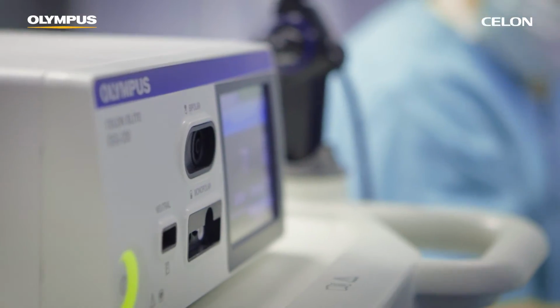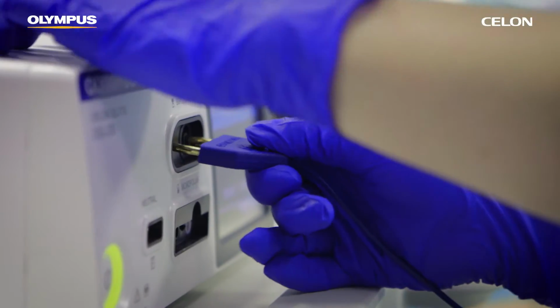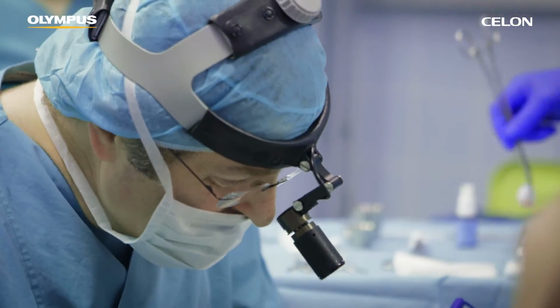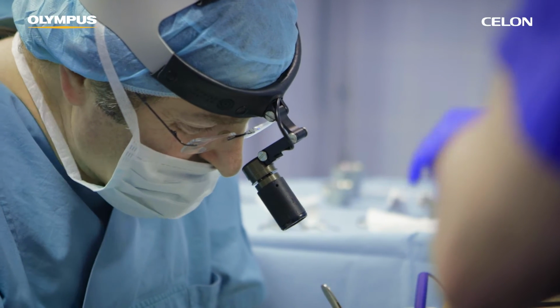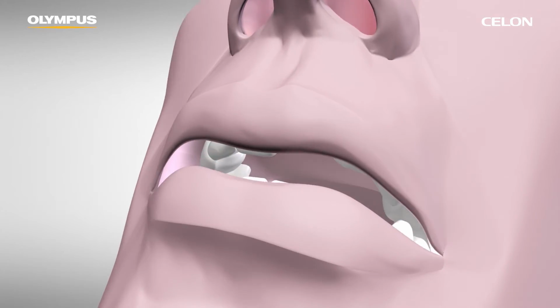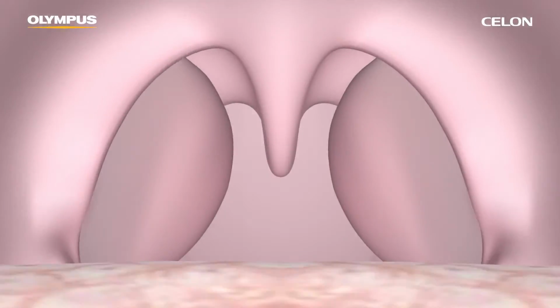The power setting on your control unit determines the extent of coagulation induction. The lower the power setting, the longer the application time and the greater extent of coagulation area. Here, a setting of 7 watts is recommended to make lesions in large palatine tonsils.